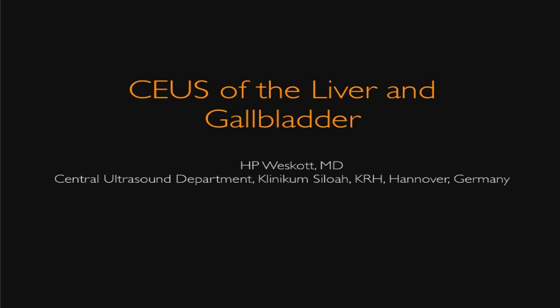Dear Carol, ladies and gentlemen, I will start with something that has revolutionized our work in ultrasound, that is contrast media. I will talk about CEUS of the liver and the gallbladder.